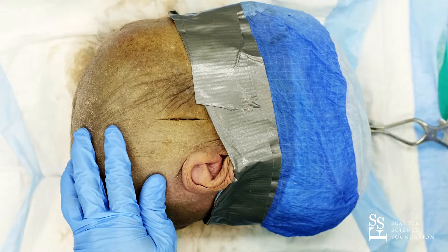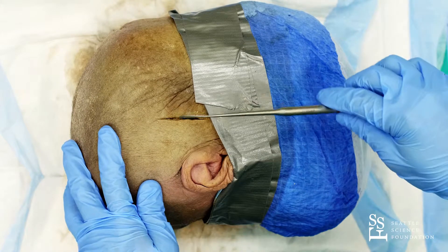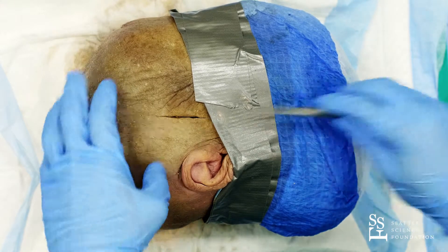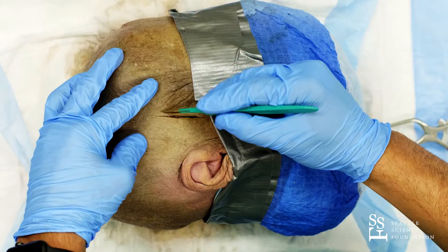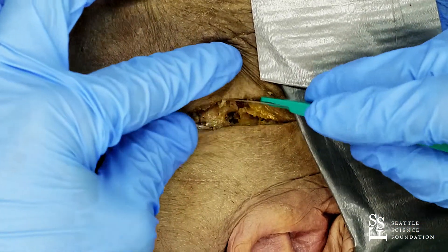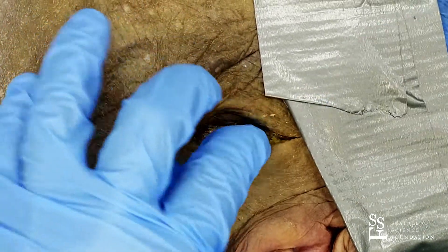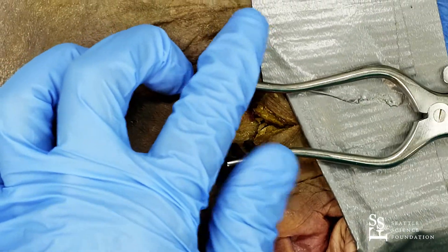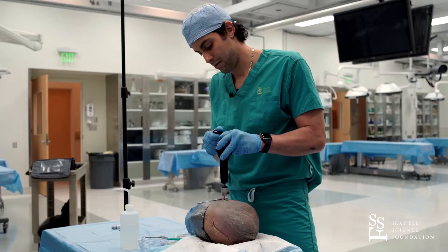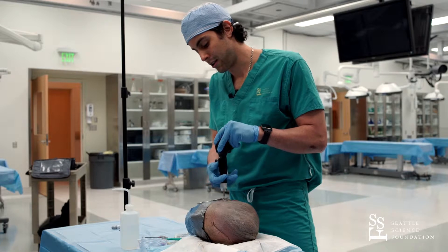There are several sites where you can do burr holes, but the first burr hole will always go ipsilateral to the blown pupil and over the temporal bone. So you get a scalpel, make an incision right over the skin all the way through the muscle onto the bone. You then dissect some of the temporal muscle and expose the temporal bone. Then you get a drill, position it over the bone, and start drilling until you feel it has crossed into a softer part.